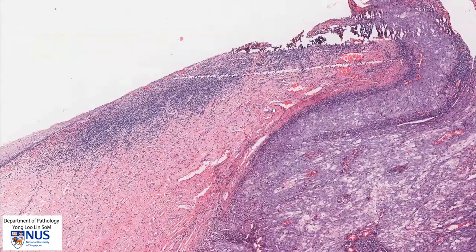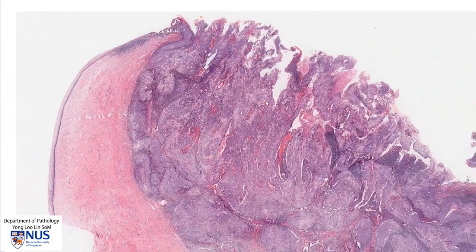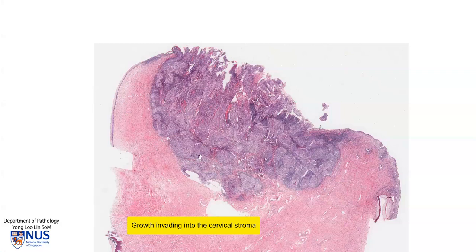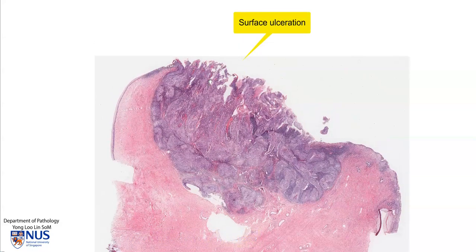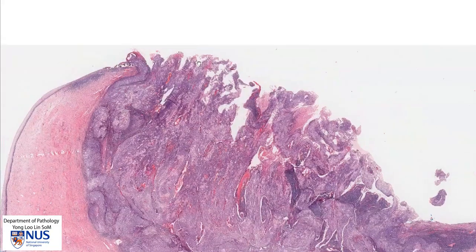Moving to the abnormal area, at low magnification we can see that there is clearly a growth that is dipping all the way into the cervical stroma, going down quite a long distance from the surface epithelium, which is markedly ulcerated. And this ulceration often explains the presence of significant bleeding in this condition.